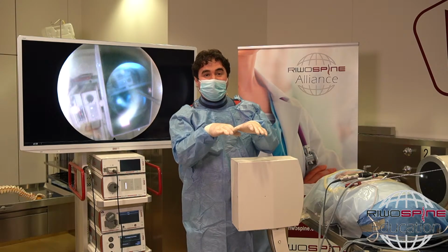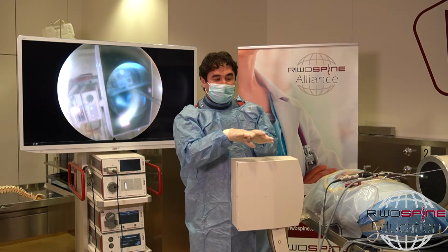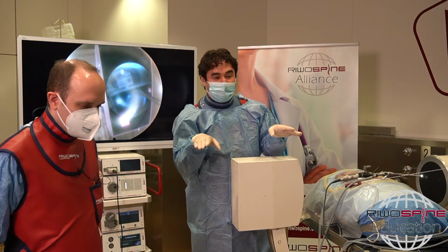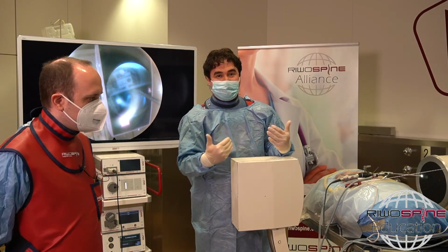Then the second important thing is the positioning of the patient at the beginning. We have to correct the lordosis of the patient first. The reason for that is, you can open the interlaminar window more, and you can also stretch the ligamentum flavum. If the ligament is relaxed, then it's not easy to open.